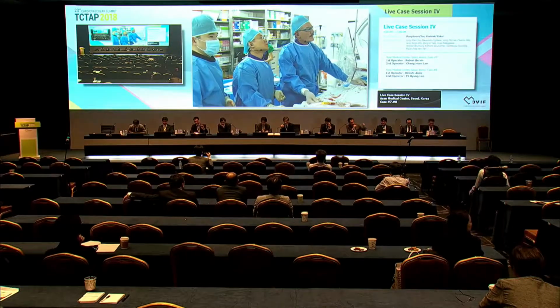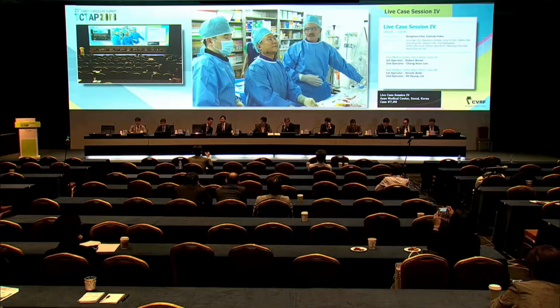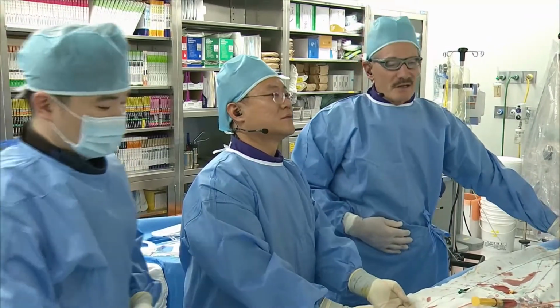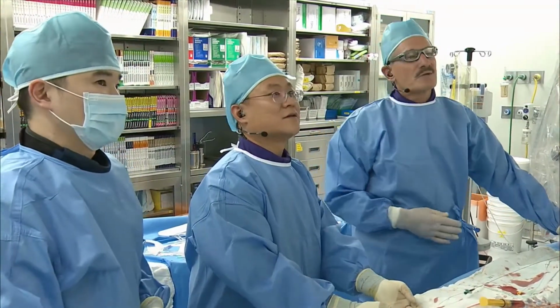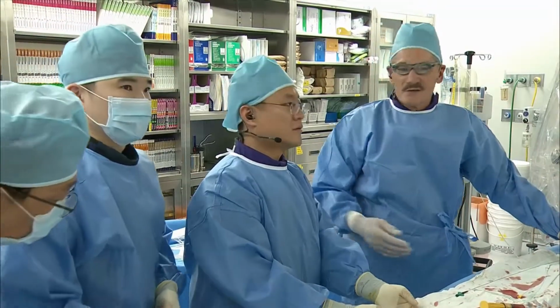Dr. Basin, could you introduce the case? Yes, good afternoon. Thank you for transmitting in to us here. I'll hand the case review over to my colleagues here. It's an iliac CTO. We think recent clinical CTO in a 73-year-old male. I'll let you take over from here.